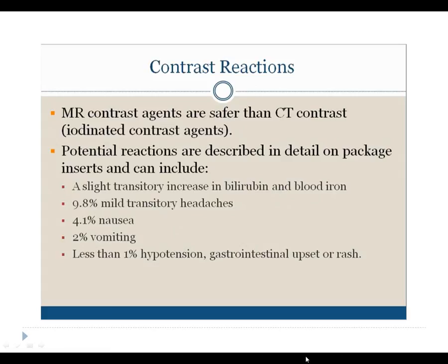It is very important to monitor any patient getting a contrast injection very closely. If a patient does have an anaphylactic reaction to gadolinium, which is extremely rare, they may not be able to communicate, and the MRI technologist must keep in verbal and visual contact with the patient and be aware if something is wrong after the injection.